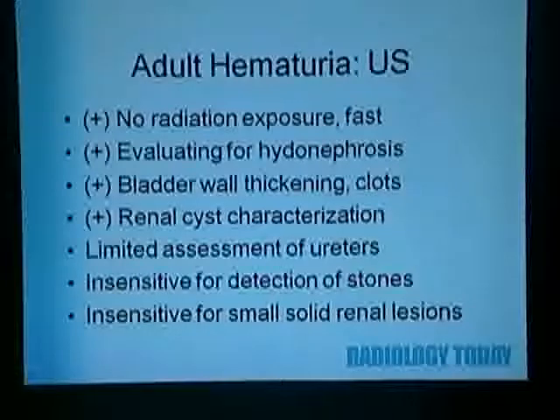Ultrasound is also good at renal cyst characterization, perhaps an equivocal cyst seen on a CT that's very hyperdense, and we've raised the question about it being solid or cystic. Ultrasound can help. However, ultrasound is a limited assessment of the ureters. It's also insensitive for detection of stones, and insensitive for small solid renal lesions. So overall, it's a limited evaluation in the broad sense for workup of hematuria.